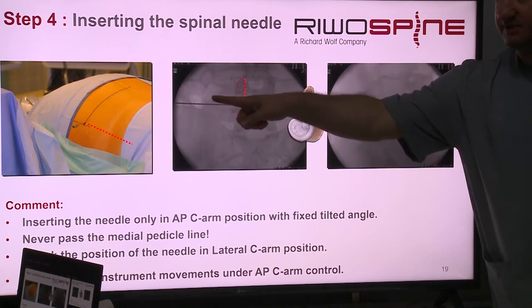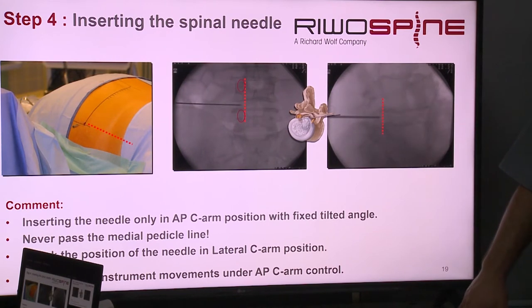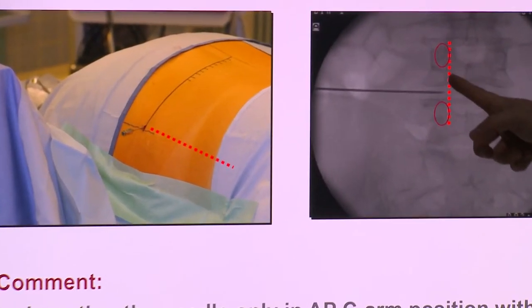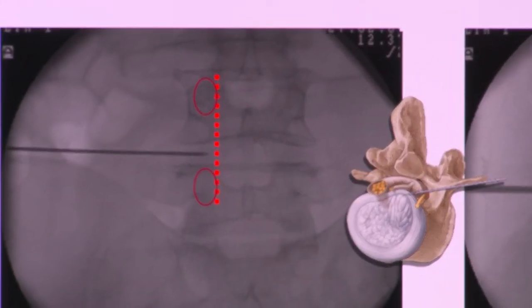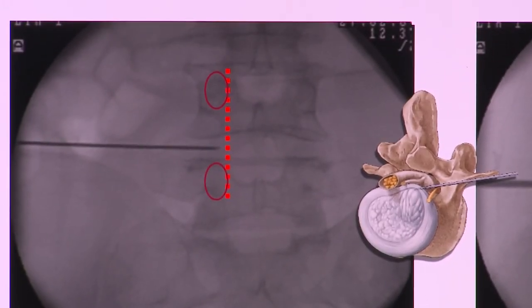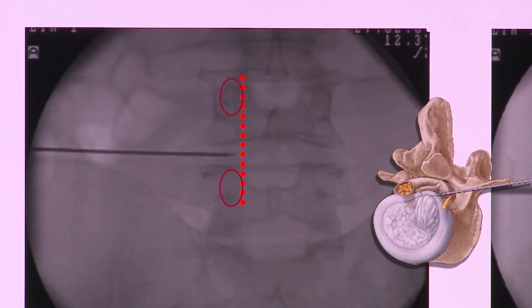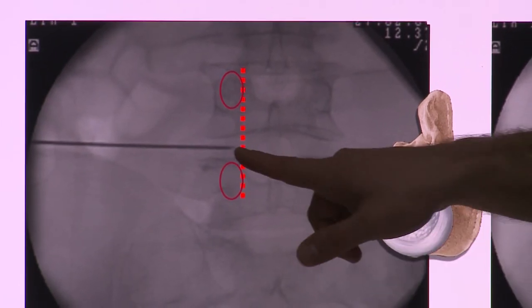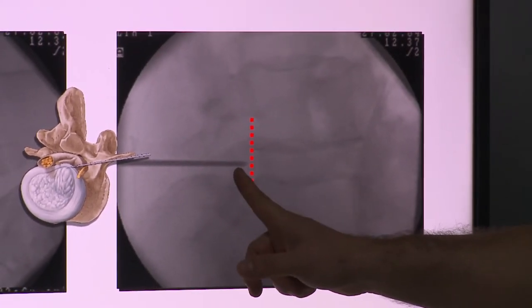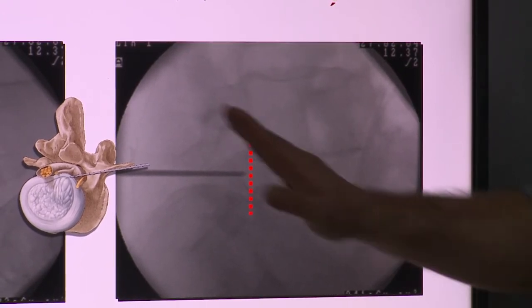And then we start with the needle. We insert the needle. Okay, the needle position at the AP view is the medial pedicle line here. Then, when you reach here, medial pedicle line, you have to reach the annulus also, the dorsal part of the annulus. Yeah. This is the target point of the needle.